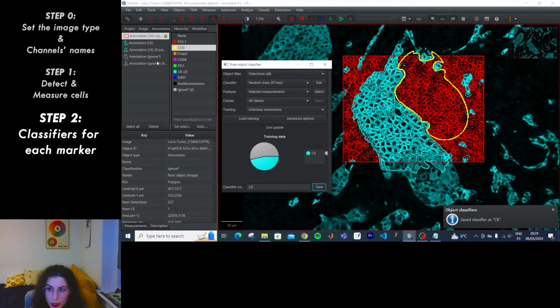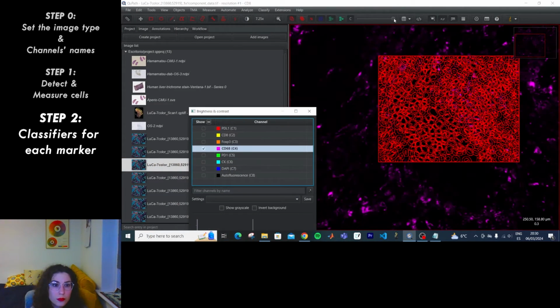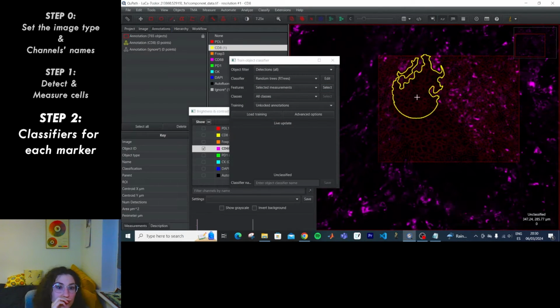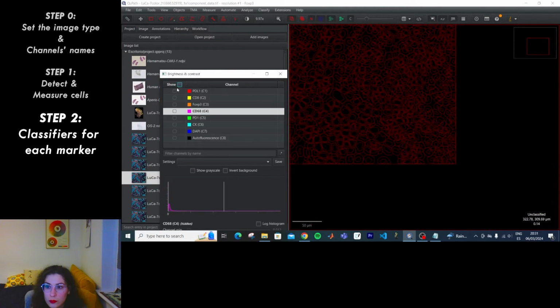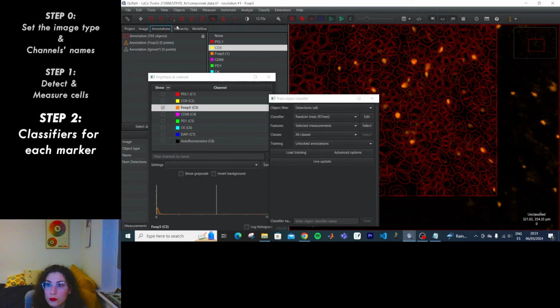Sure, override. Hi, voiceover Laura here again. I sped this up while I trained the classifiers for each of the markers because they all worked. I did the exact same thing for each and every one of them, but it did take me around 10 minutes. So if you don't enjoy sped up videos, you can go to 1505 seconds and you'll be alright.